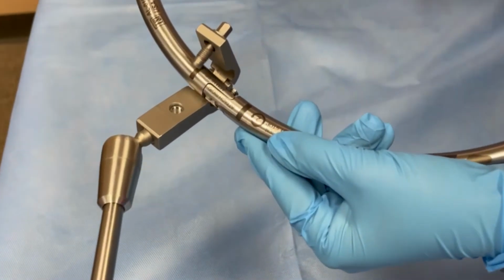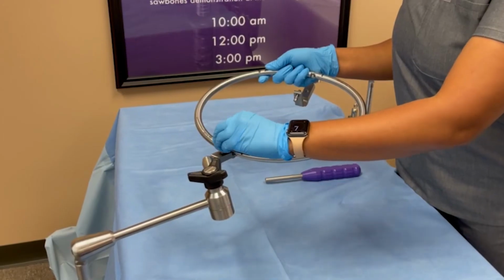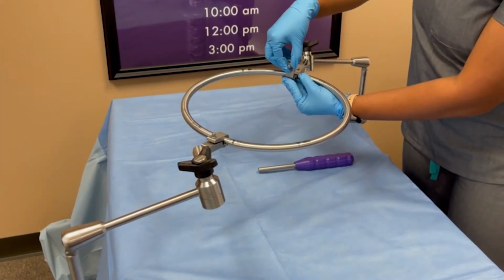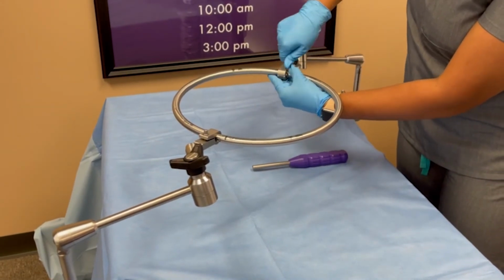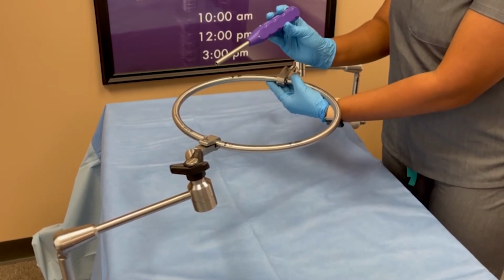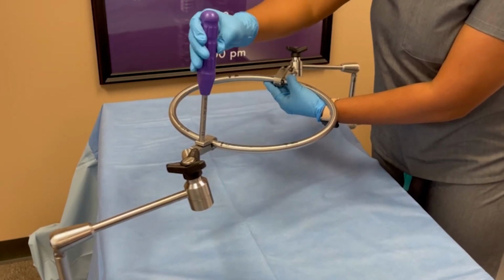So position your articulating arm inside the clamp, fold it over, and hand tighten the screw. You're then going to do the same thing on the other side. Position the ring in the clamp and then hand tighten this with the screw. And then take your AL-1000 hex wrench and tighten down the clamps.